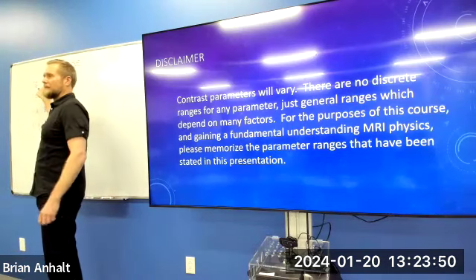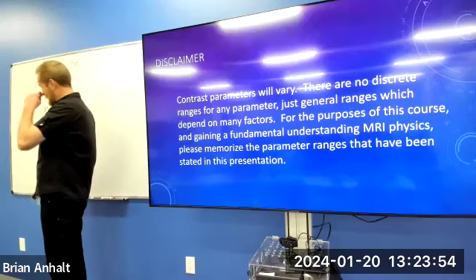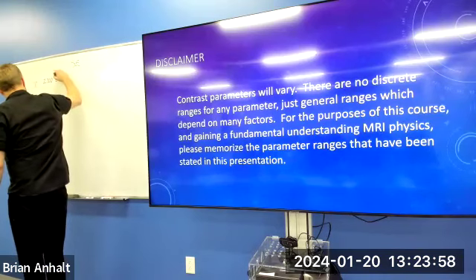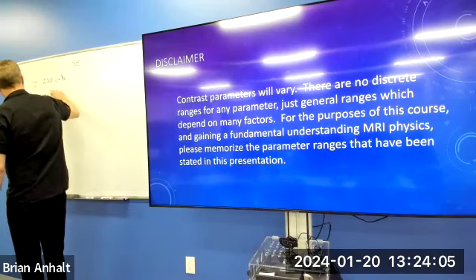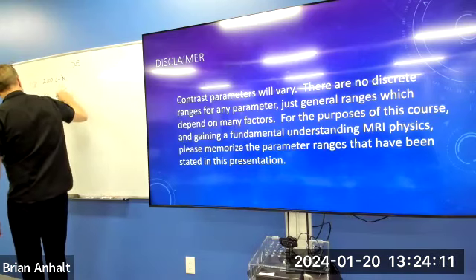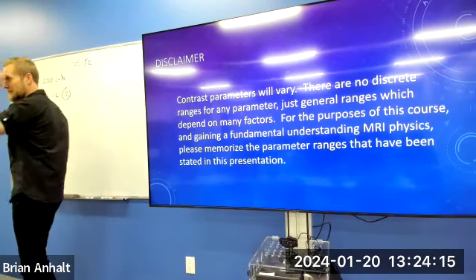Long or short TR? What has that done? What is this, long or short? Long. What has that done for us? It's enhanced T2, right? That's your answer right there.